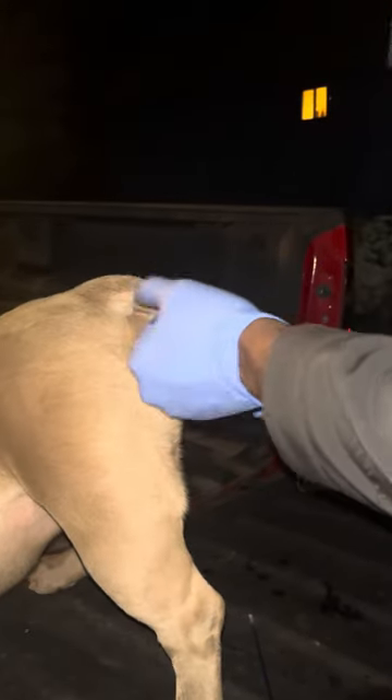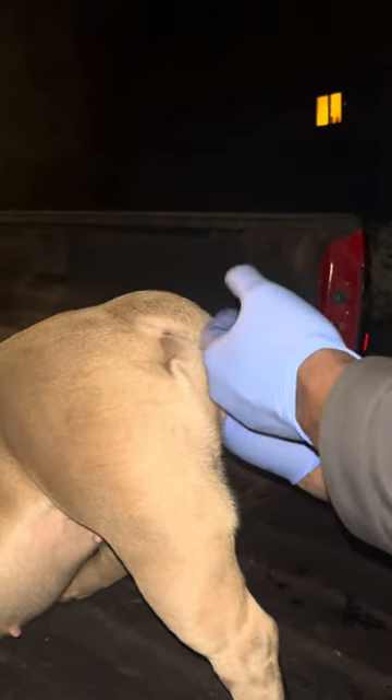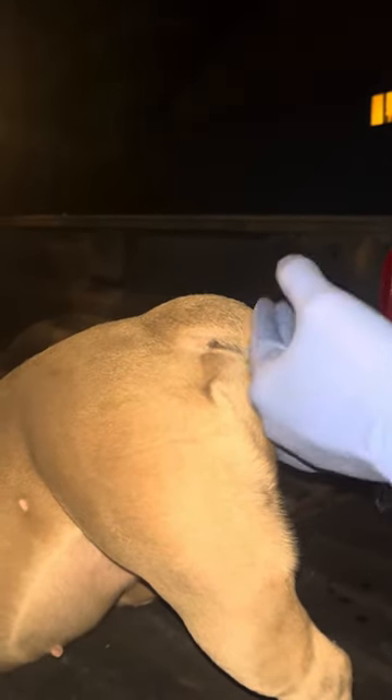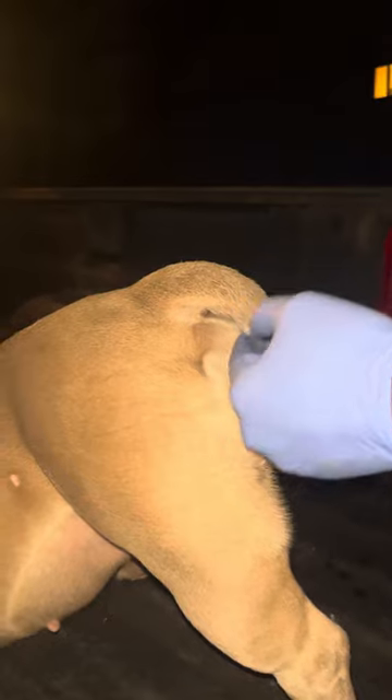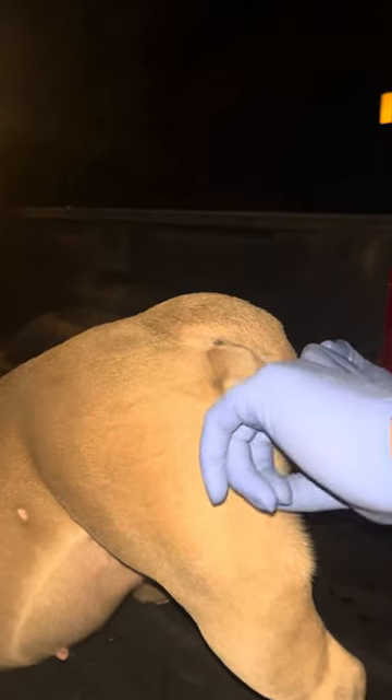I need some hands-on, man. I got you, fam. You do that. And basically, you do this to stimulate her. How long do you do that? About three minutes. Three minutes. So she can contract and sperm all the way into it. So all you're doing is stimulating that by playing with this little part, this little pad right here.